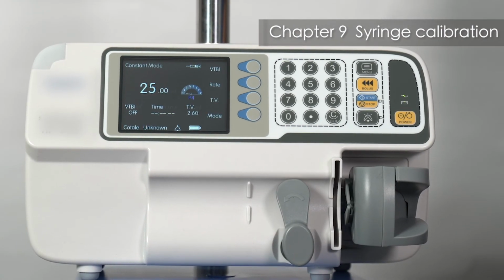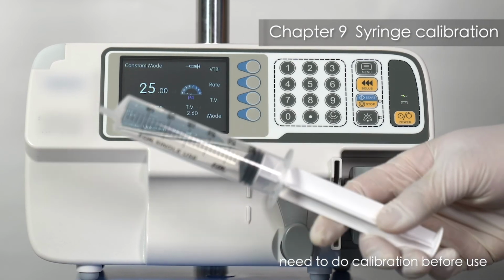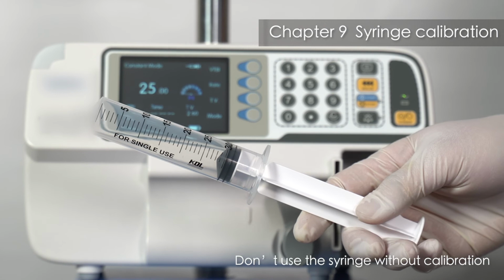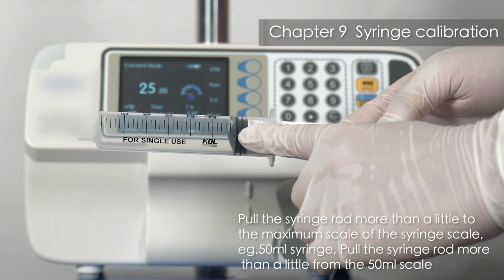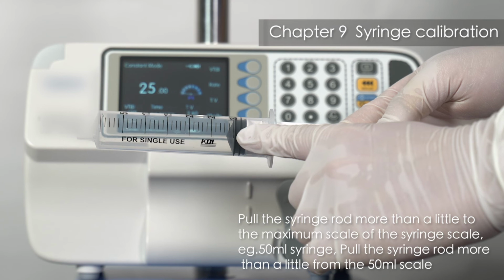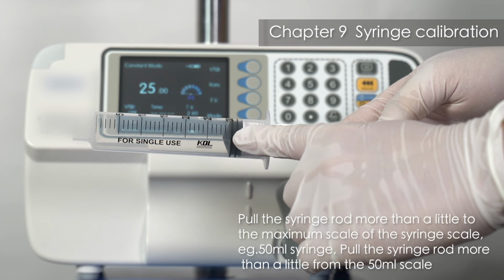Chapter 9. Syringe Calibration. New syringe pump or new brand syringe need to do calibration before use. Don't use the syringe without calibration. Prepare one new syringe. Pull the syringe rod more than a little to the maximum scale of the syringe scale. For example, 50 ml syringe. Pull the syringe rod more than a little from the 50 ml scale.